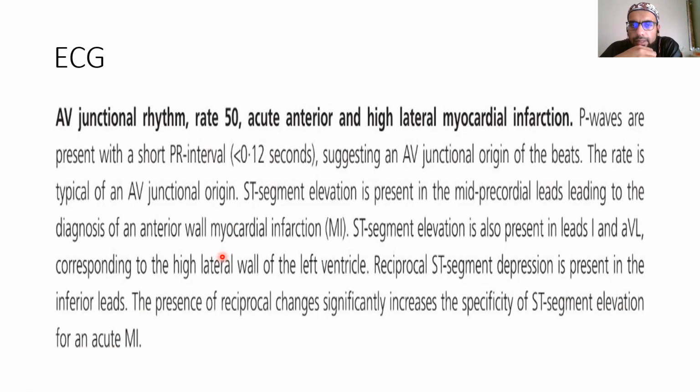If you guys haven't, have a look at the algorithm for ACS management. And in your area, I would suggest that you put it up. What I'm going to do for a second, just while we are going through, let me just see if I can get up the algorithm quickly. I'm going to try and put it on the screen just so that you guys can see exactly what it is. So let me just get that on computer.